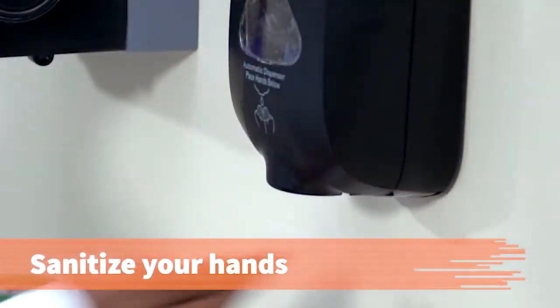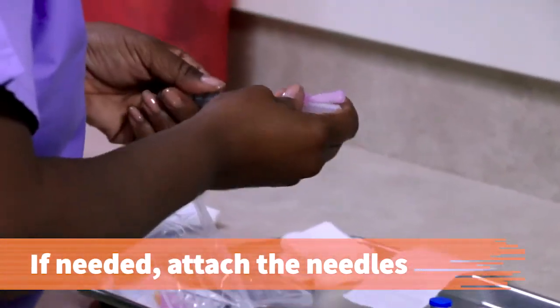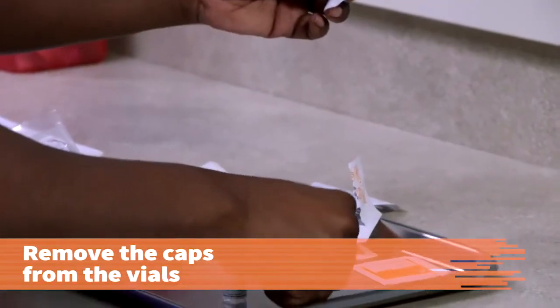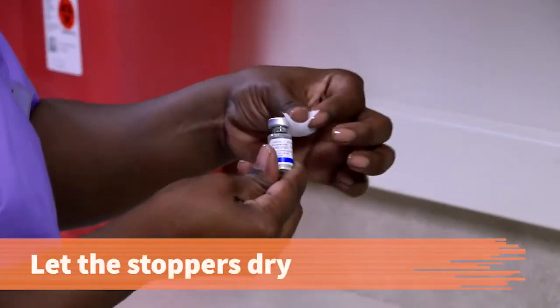Wash or sanitize your hands. Open and assemble the syringes and needles. If needed, attach the needles to the syringes without contaminating the units. Remove the caps from the vials. Clean the rubber stoppers of both vials with alcohol wipes.